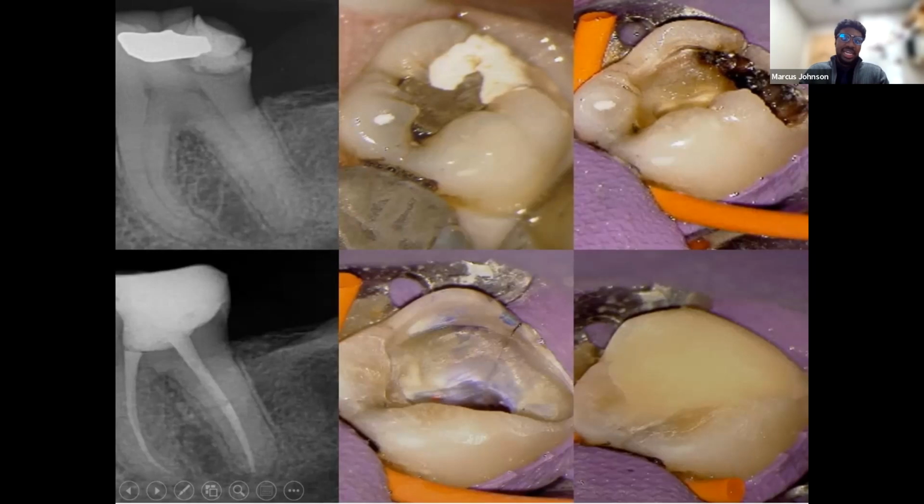Completed the case, placed a nice fiber post. Some may argue fiber versus metal. I used the fiber just to kind of mimic more the modulus of elasticity of dentin. Just based on this case, was able to bond my core. Obviously, stained with the methylene blue, you can see that crack, but it did not extend down into the furcation. So we'll see what happens. So I was under isolation, restored the tooth, sent it back to the general dentist. Please restore ASAP with the permanent crown.